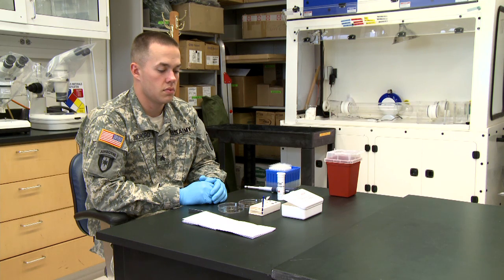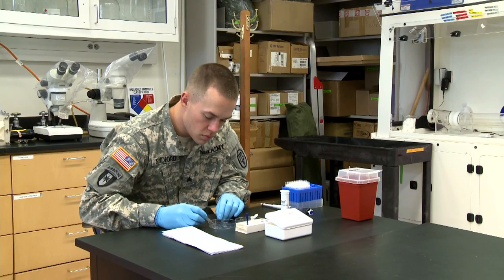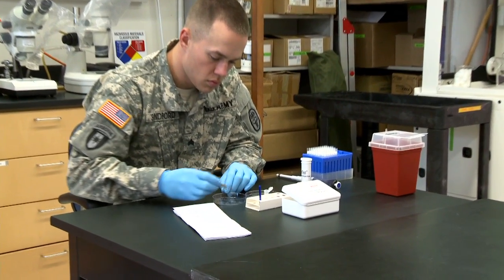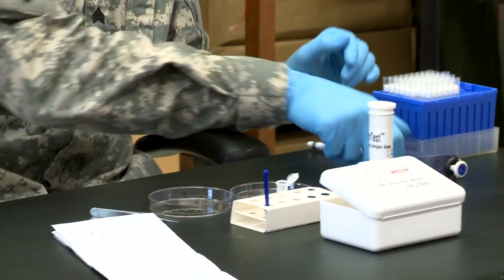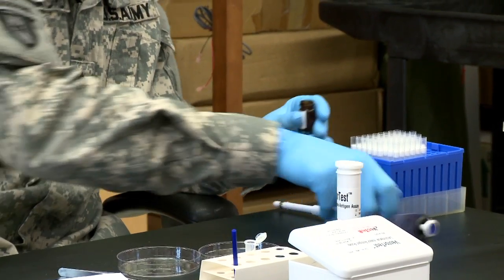Procedures for detecting leishmaniasis in sandflies are as follows. Place sandflies into the conical grinding tube provided in the kit. Place the tube into the tube stand provided. Dispense 250 microliters of grinding solution from the grinding solution bottle onto the sandflies.